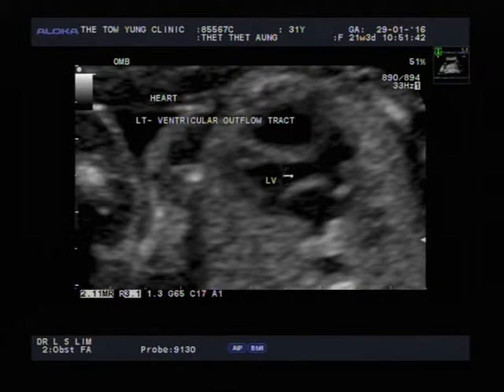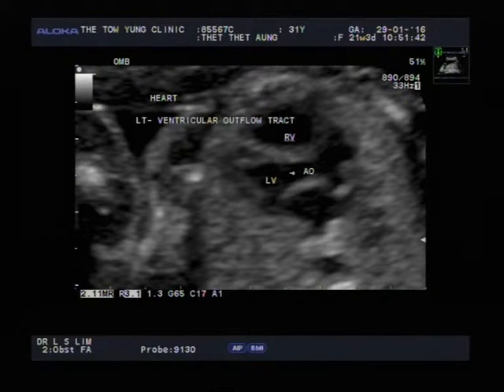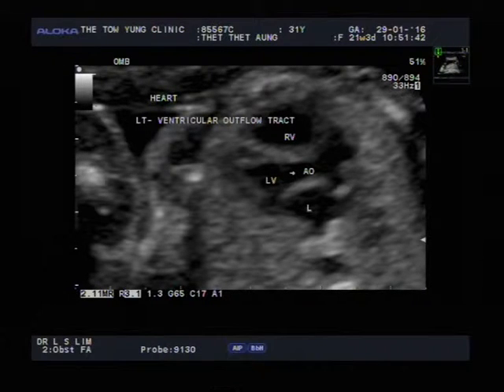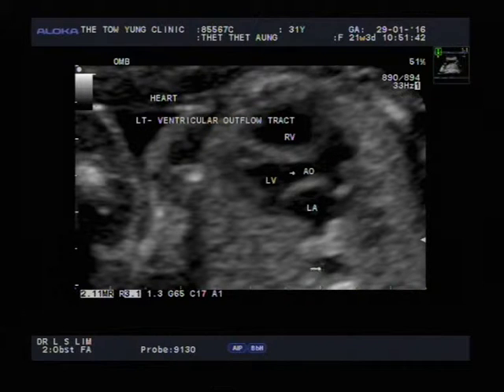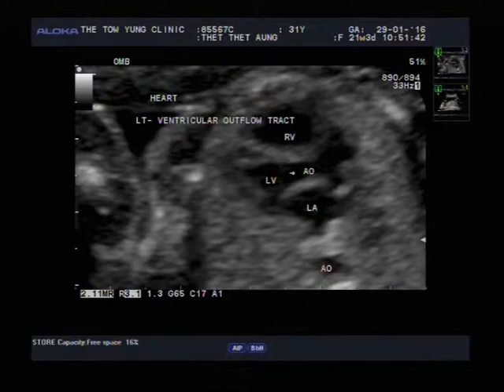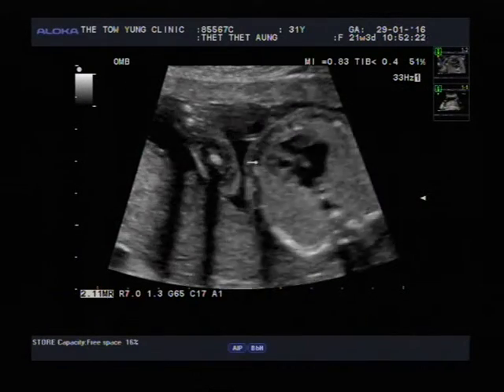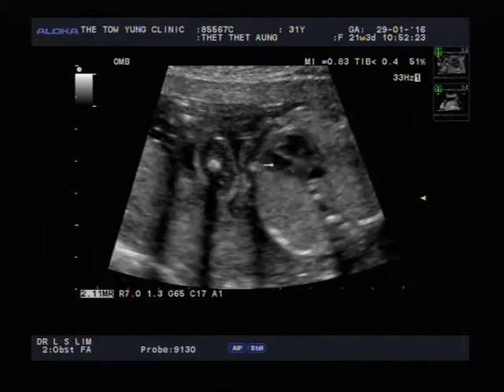The connection from the left ventricle is to this blood vessel, which is actually the aorta — the main artery from the heart. You can see a bit of the right ventricle over there and the left atrium over here. This is a normal view. The aorta goes right around the back of the baby's heart. I'll show it to you again — watch the chambers carefully.